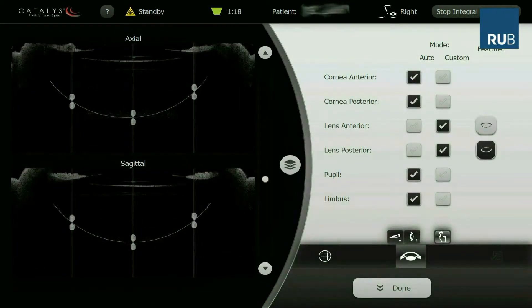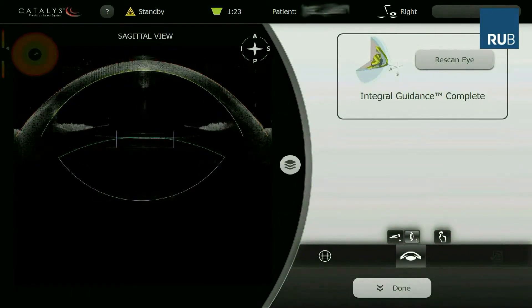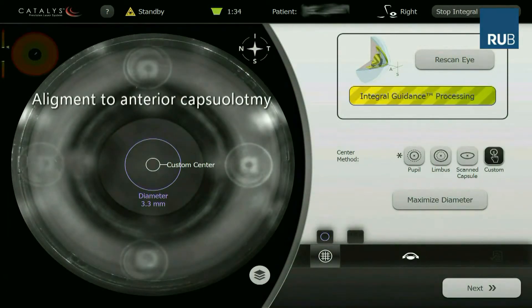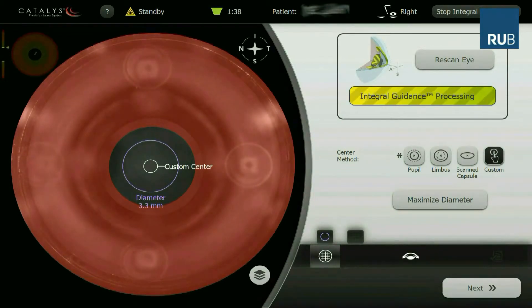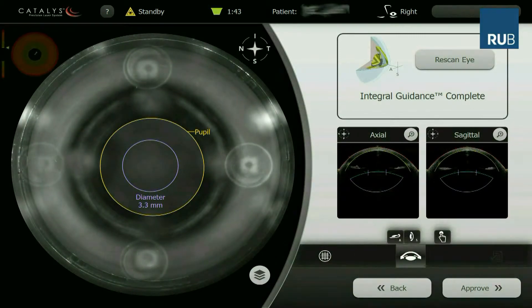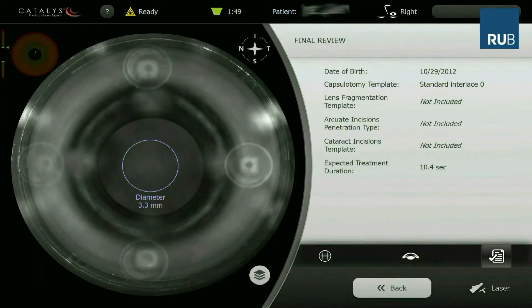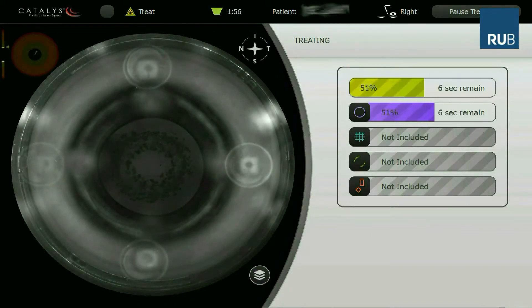The posterior capsulotomy is individually aligned and centered to the anterior capsulotomy and the position reconfirmed. The laser creates the posterior capsulotomy as if it is an anterior capsulotomy. In this case, it starts in the vitreous anteriorly and the cavitation bubbles around the floating capsulotomy can be observed on the infrared camera.